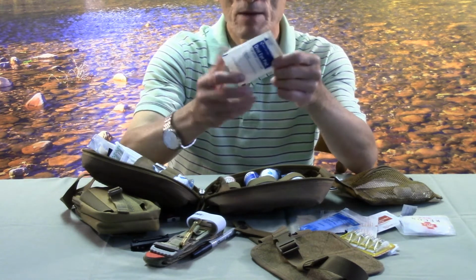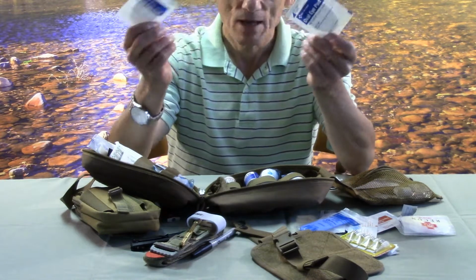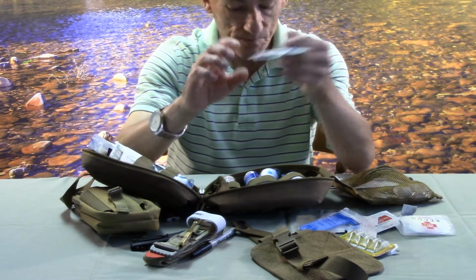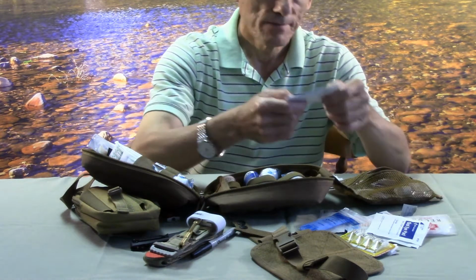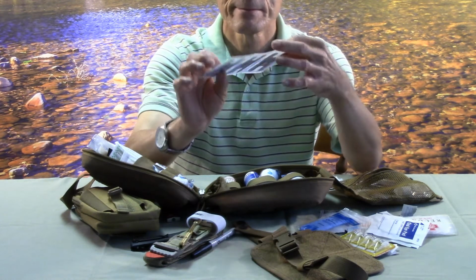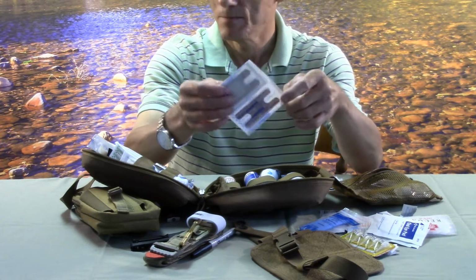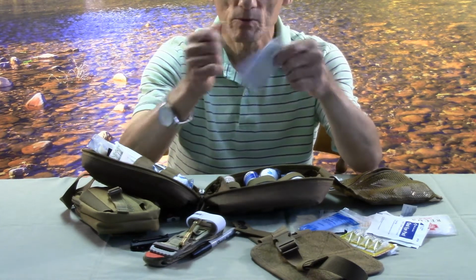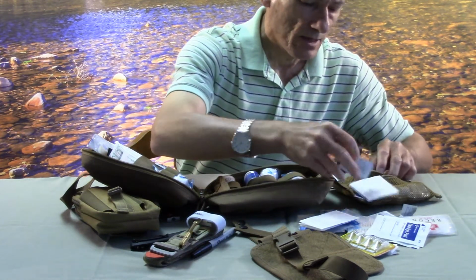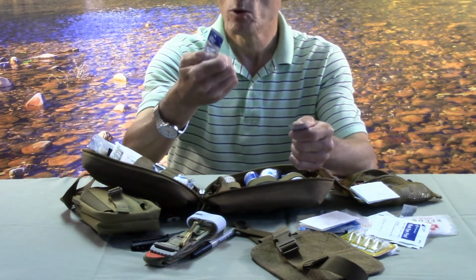And okay, oval eye pads. Now I got a couple of them in there. Hopefully I'll never need to use both of them or even one of them, but just a nice thing to have. Different types of Band-Aids. These are basically for like knuckles or fingertips. The terminology actually escapes me right now, but anyway, little ouchie boo boo type things, little triple antiseptic ointment.